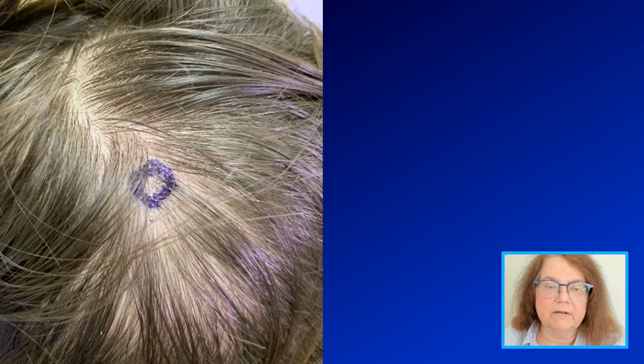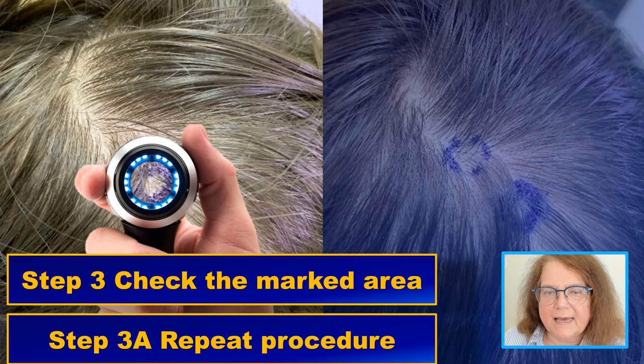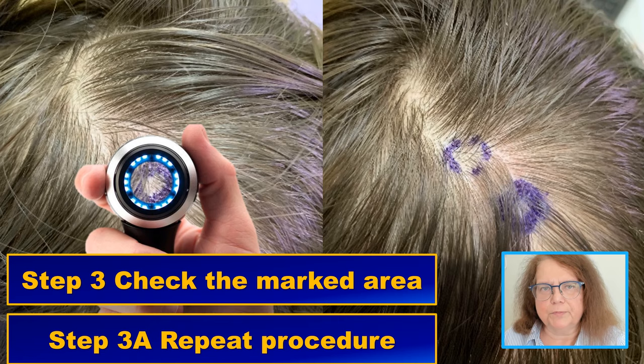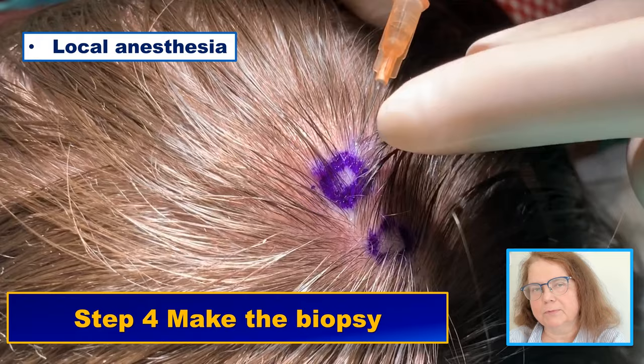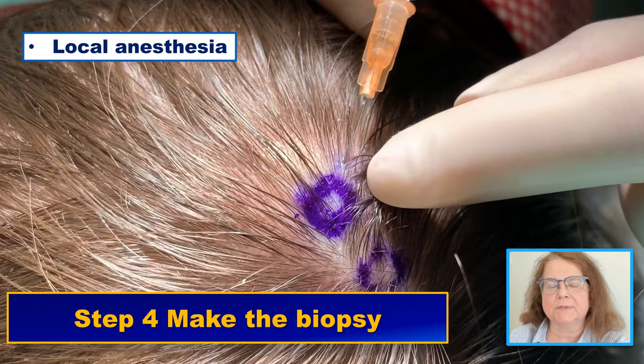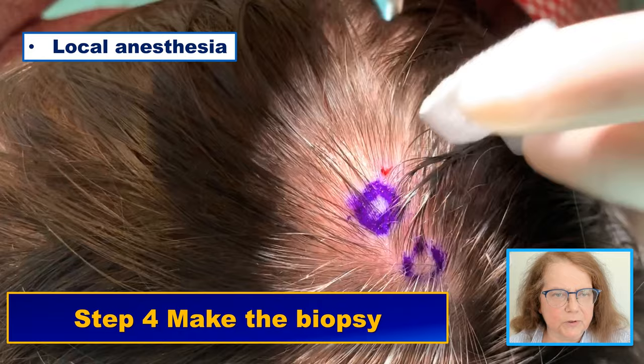We have our circle and we've performed trichoscopy. If we are happy, we go to the next step. If we are not happy because our circle is outside of the important trichoscopy features, we can redo the procedure, make another circle, and repeat as long as needed until we are happy with what we have in our circle. Once we are ready to perform the trichoscopy guided biopsy, I mark the correct circle with a darker, thicker marker to make sure that we take the biopsy from the correct area.